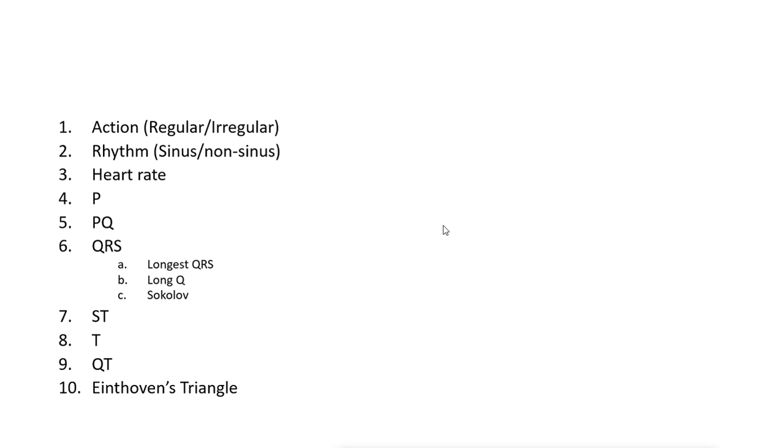So you just have to write down an exclamation mark next to point 1 or something like that, because the patient's rhythm is irregular, but you don't have to interpret why it is irregular. You mark that QRS is prolonged in lead V1, but you don't have to conclude what that means, like a long Q means scar after myocardial infarction. You don't need that. The goal is that you just mark that QRS is prolonged in lead something. You write that down next to it, in that sheet that you have. So without further ado, time to start.